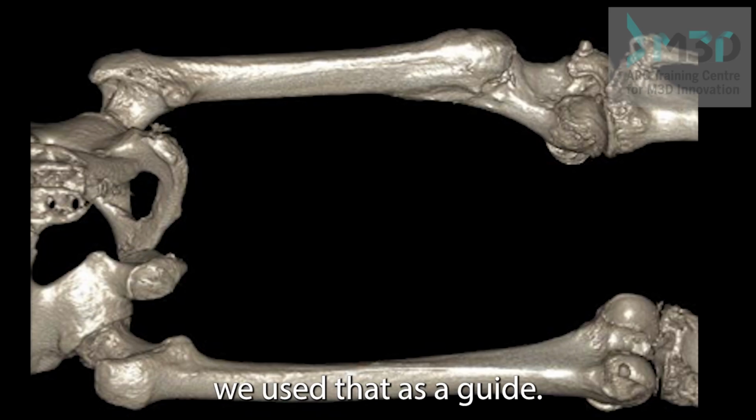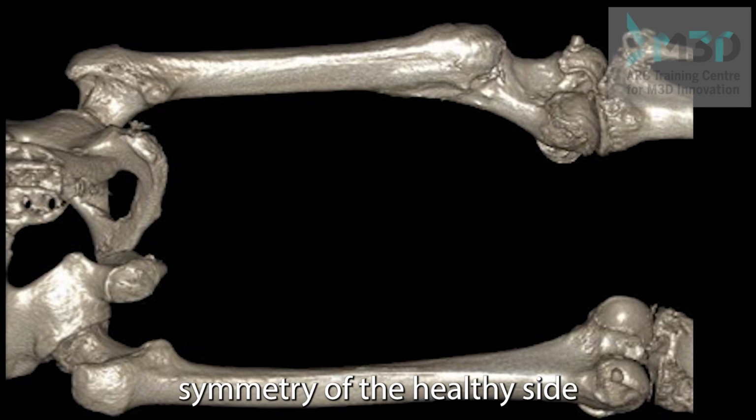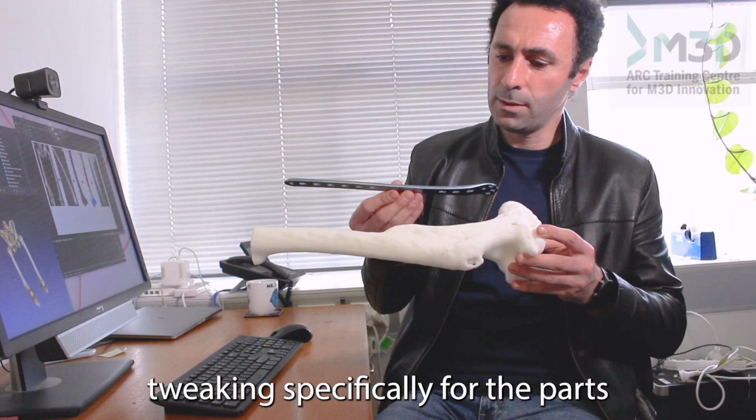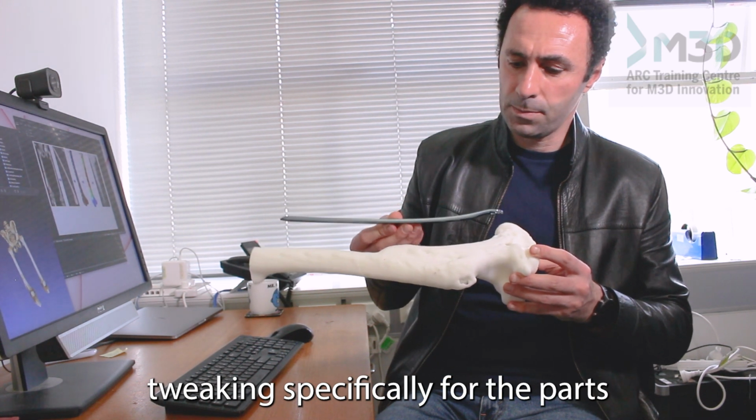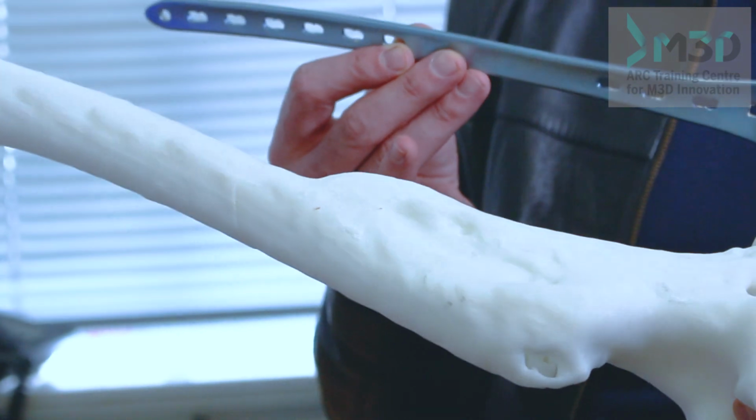So what we did, we used that as a guide. We used the mirror symmetry of the healthy side to design a plate that could roughly follow the contour or the shape of the patient's femur. And then we did tweaking specifically for the parts that were traumatized over many, many decades.